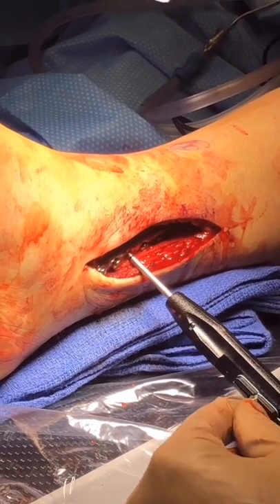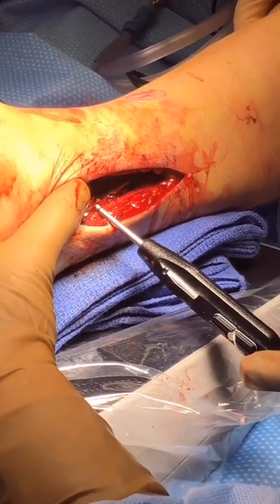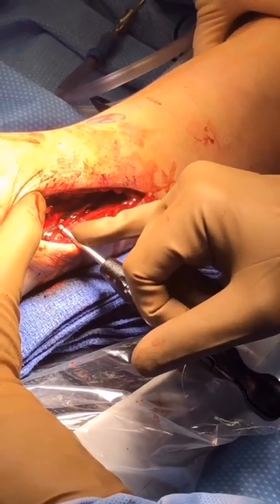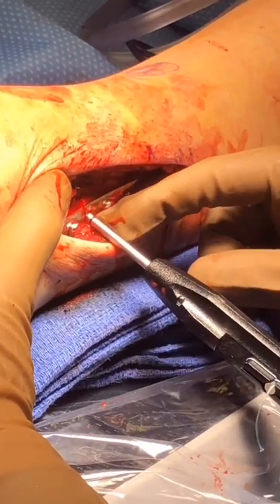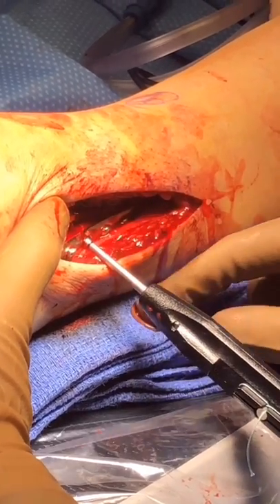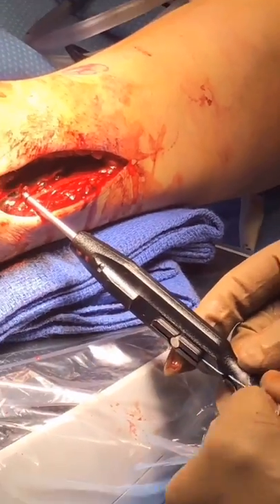Here you can see the indicator laser line. If it is exposed, we will go ahead and use the standard short button. If it is buried in the fibula, we will use the long button. In this instance, it was exposed, so we will use the short button.